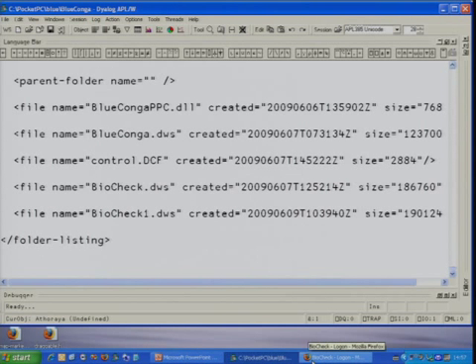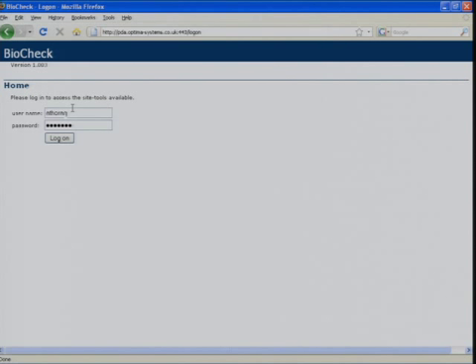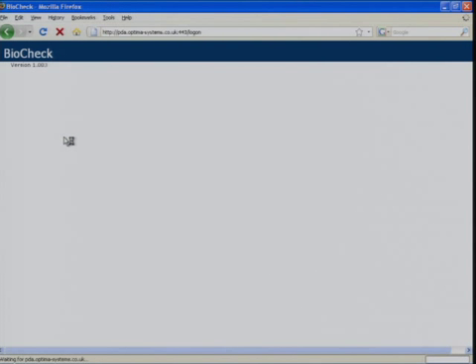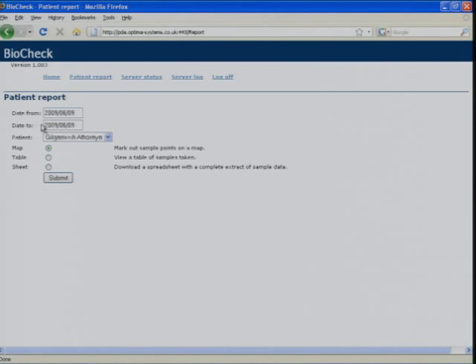I have a GPS sensor as well on the phone. So the idea is that you could track a patient to see if you need to contact them, or if you need to see where they are. I don't think they would like that, perhaps, but it would be handy if, for an emergency, you could find their location straight away. So you put all the real-time data, and if need be, you might want to send an ambulance or at least contact them to see if they're okay. So you can log on to this web application and track the patient.